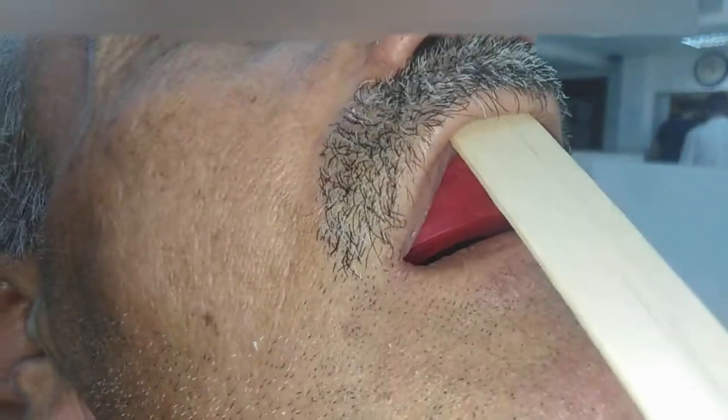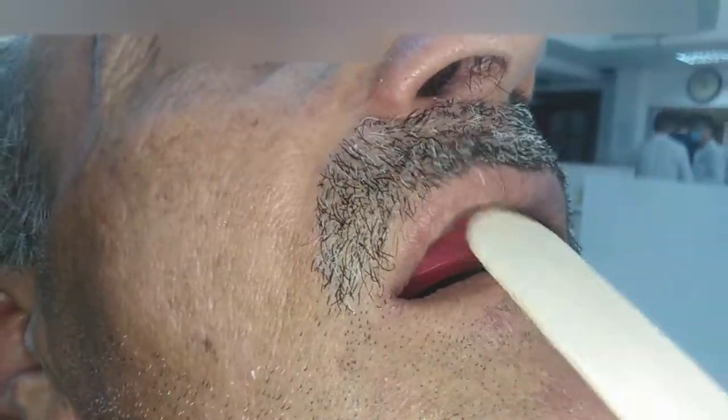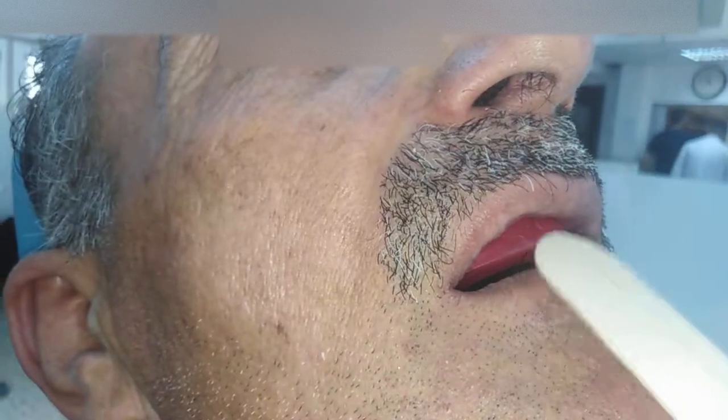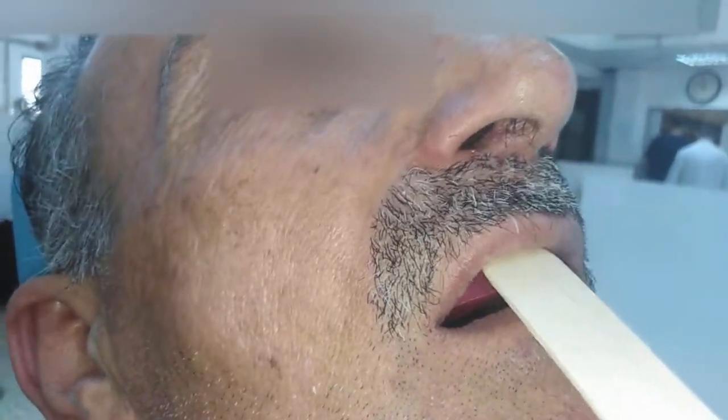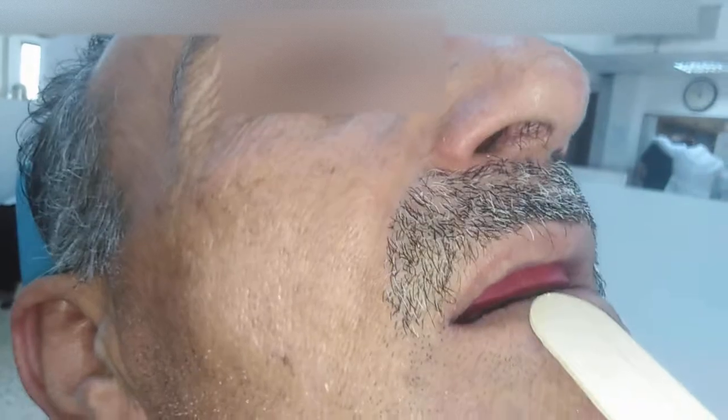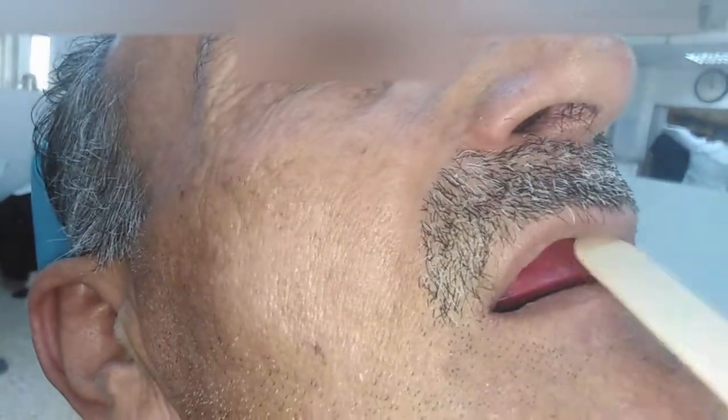One of the problems students have is that they look at the tip and don't look at the wax in the middle. Lip fullness comes not only from the wax at the tip — you also sometimes need to fill in the wax in between the tip and the flange of the base plate. So add fullness here as well; it's not only added to the tip, you also add to the labial surface.